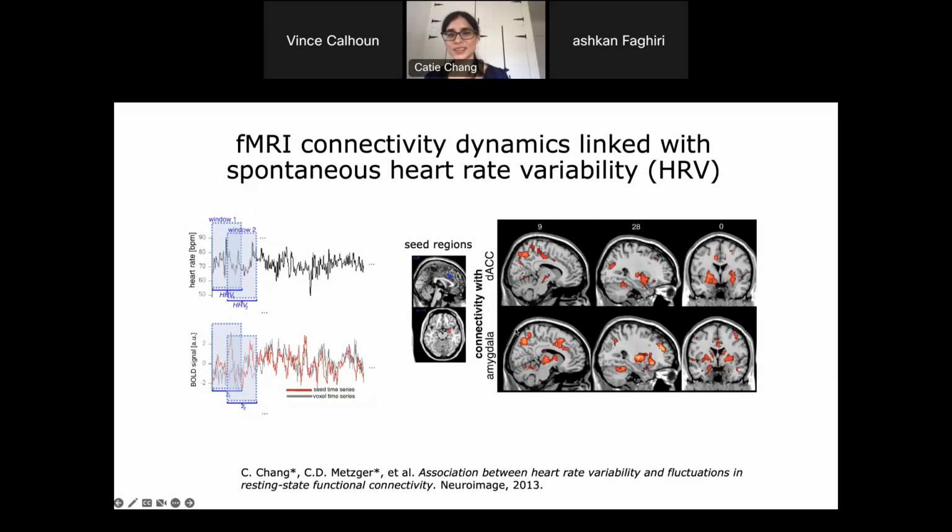It's kind of tricky to study these physiological states because there may be neural and non-neural effects of these systemic signals, but we also tried to regress out changes in respiration, et cetera, in order to isolate as best as possible some of the connectivity changes that were happening here. Heart rate variability has been used throughout the literature to indicate a parasympathetic nervous system state, and is also known to be altered in major depressive disorder and other types of neuropsychiatric disorders. So potentially it could be interesting to relate some of these physiological indices to subjective or mood states in affective disorders, for example.